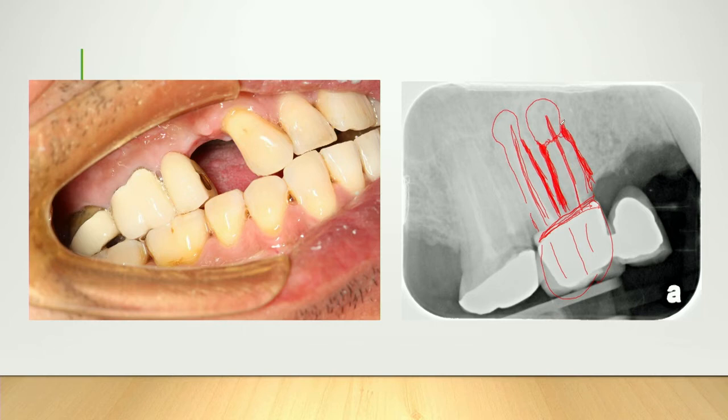And then if you remove enough interseptal bone, and in this case there's plenty of room mesial, so I would go mesial. I would be wary not to go too much distal, then you're actually going to remove the undercut that's holding your bulbous root in place. And that root will then be easy to take out. It's very, very tricky to take that root out if you fractured that bulbous root.